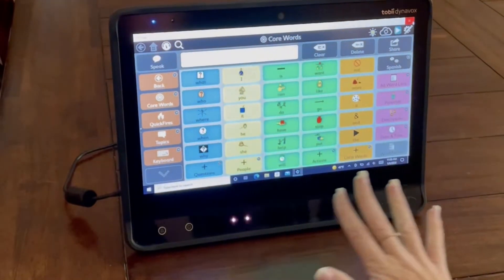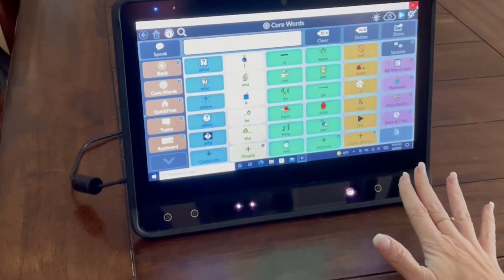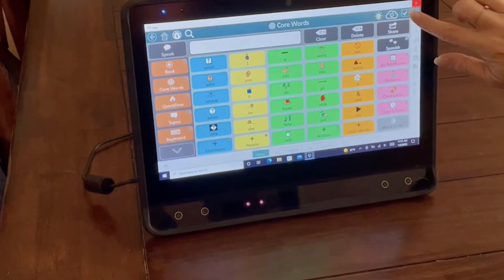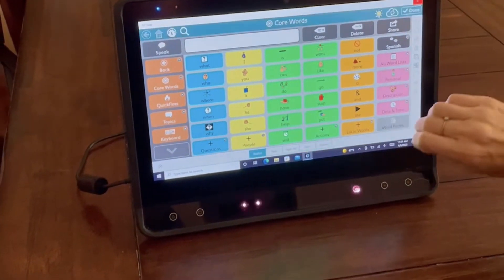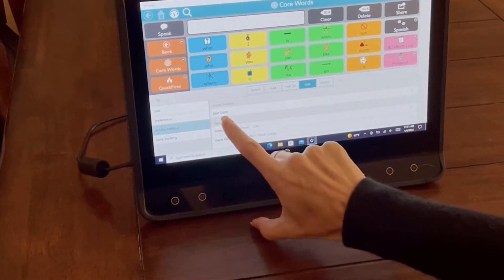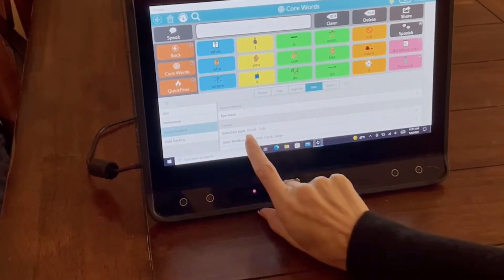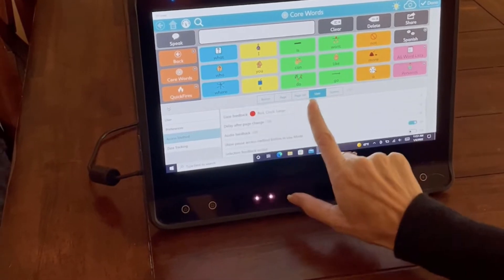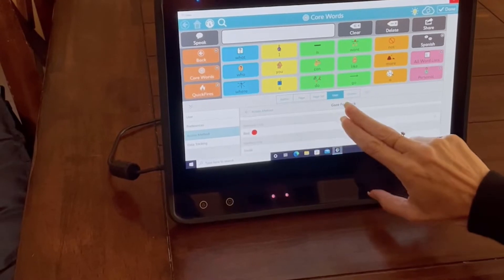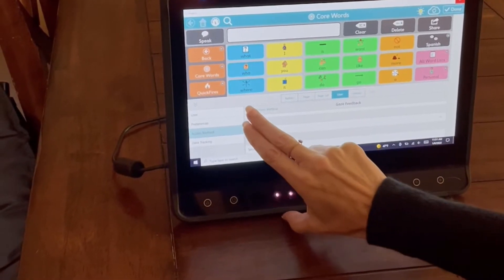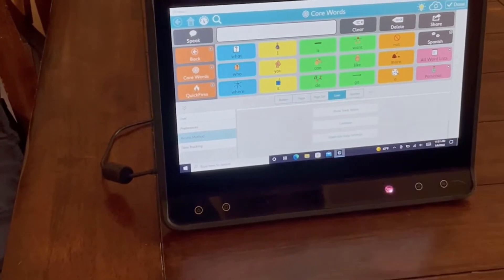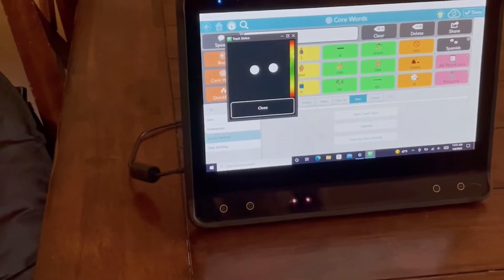This is the Tobii Dynavox with Snap Core. If you go into the settings, then the user and the access method, you can set it to eye gaze, set your dwell time, and choose what kind of feedback you want — it can be a shrinking dot, a clock, or in the color you want.